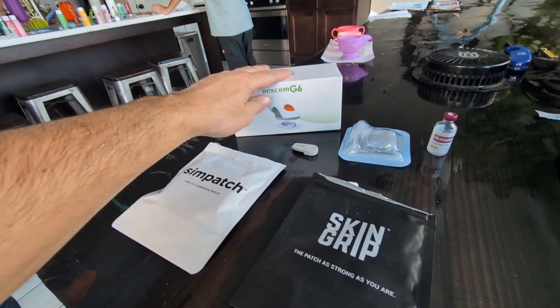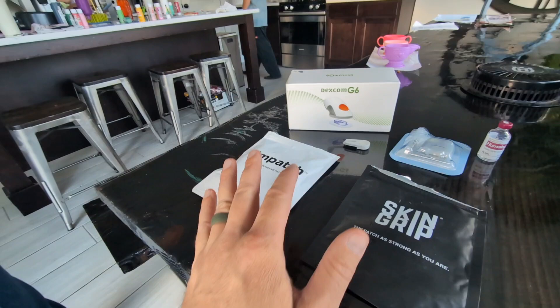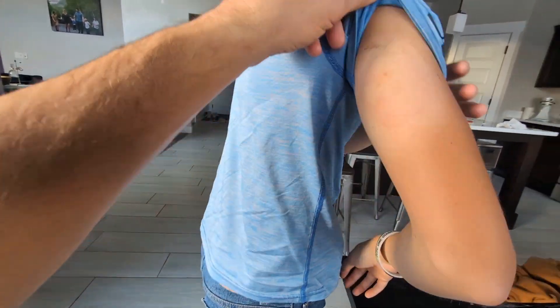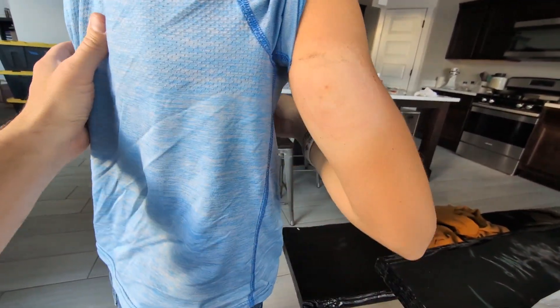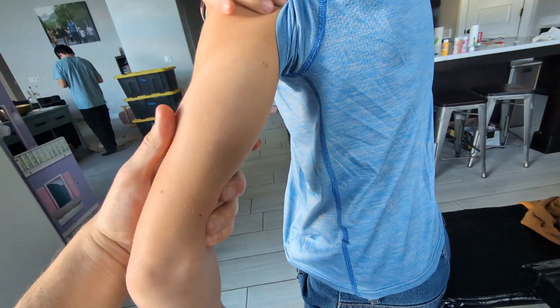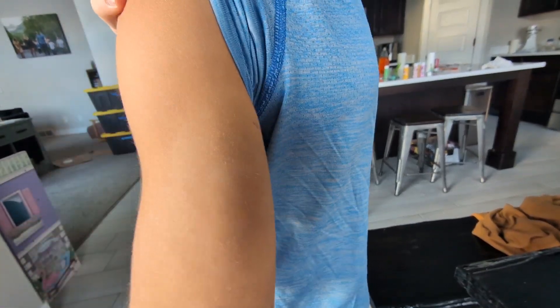Today we're going to be putting on a new Dexcom G6 as well as an Omnipod 5, as well as overlay patches. Riker's choosing to do these on the back of his arms this time. This is where we had one last time — that one bled a little and didn't do so great, so we're going to do it in a different spot. That side looks pretty good. He wants to do his pod, which is the pump, on this side, and the sensor, the Dexcom, on the other side.